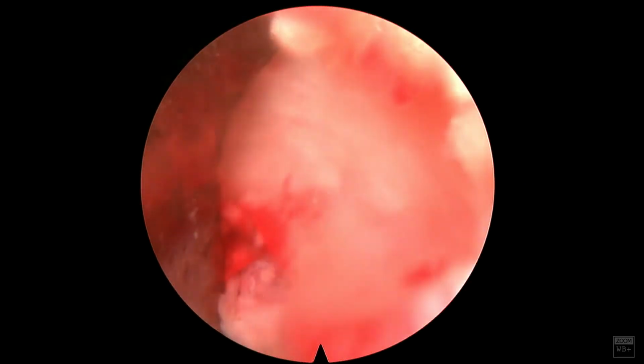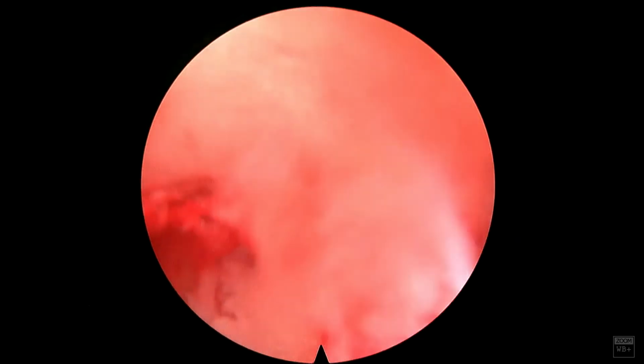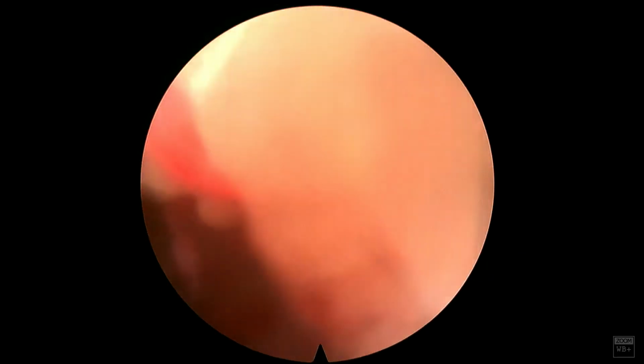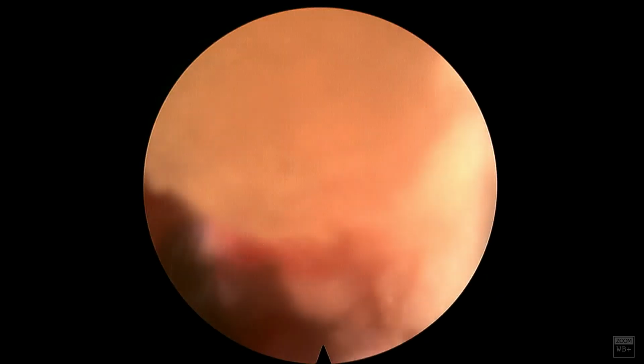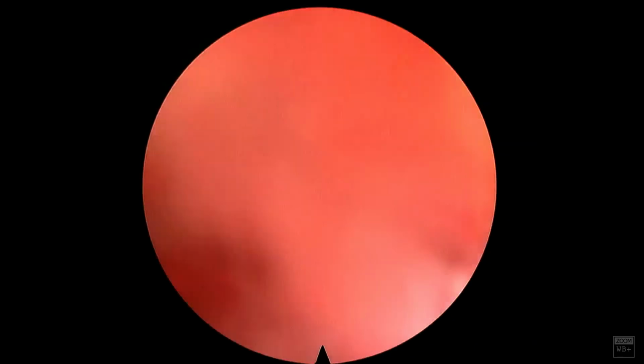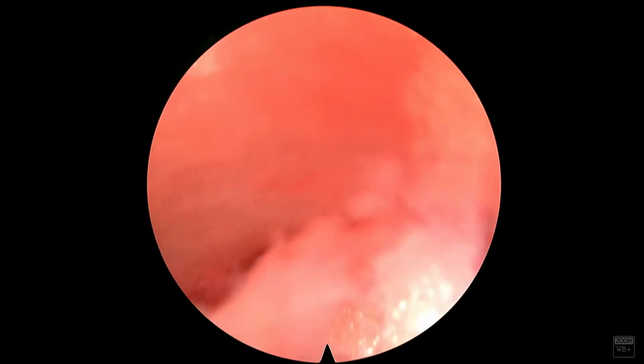So we used a trans-SAP approach in this procedure. That means docking the working sheath onto the most cranial aspect of the superior articular process of S1, and then advancing reamers down into it. What that does is it removes the most cranial aspect of the SAP and enlarges the foramen so we can do most of our work.